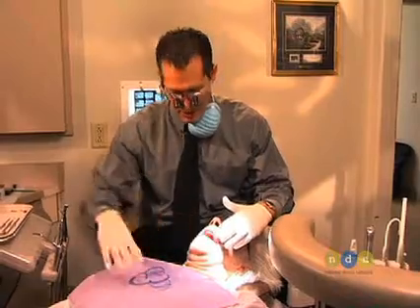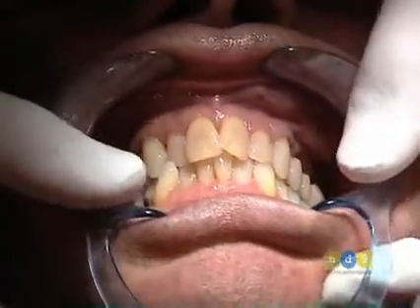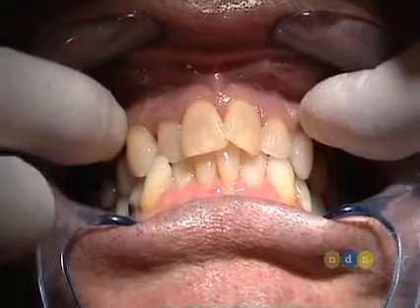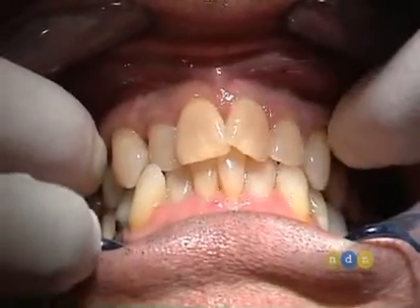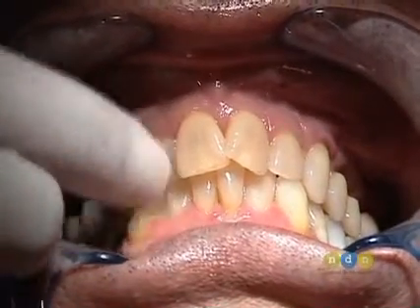We're going to be doing an upper reconstruction here. I'm going to put some cheek retractors in so you can see our occlusion. Bite down for me. This is the occlusion. As you can see, there's a number of crowding issues, especially in the pre-maxillary area, which we're going to be redistributing the spaces for the new smile design. We also have a cross bite issue right here on the right side.